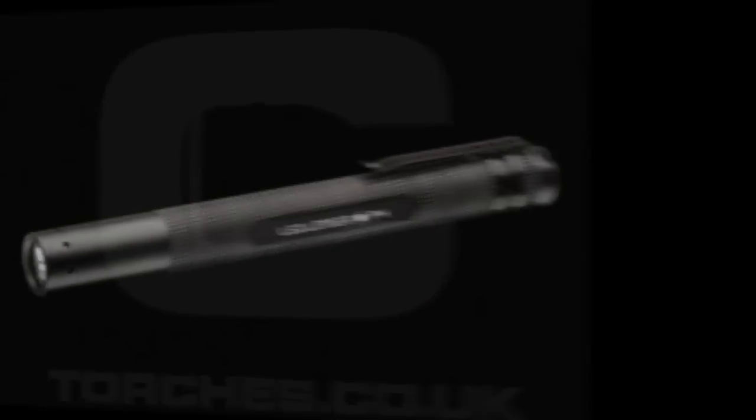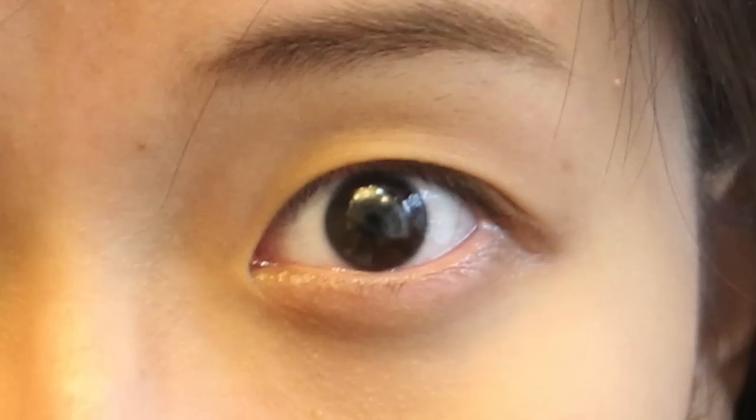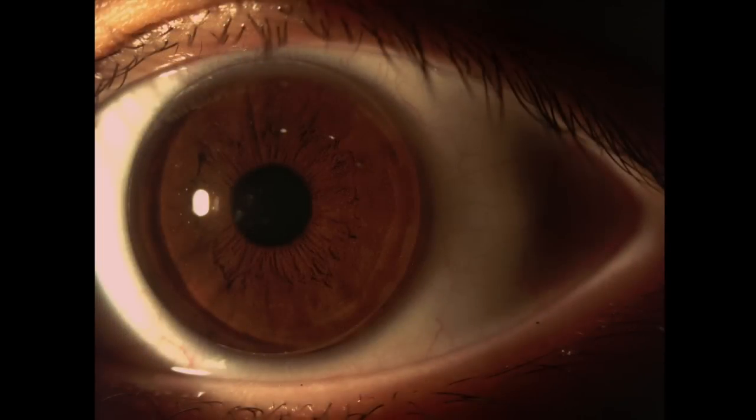Take a pen torch or use the light from your phone to check for any bubbles that may be trapped between the lens and the cornea. You do not want any bubbles trapped in between, but instead you want a smooth tear layer.